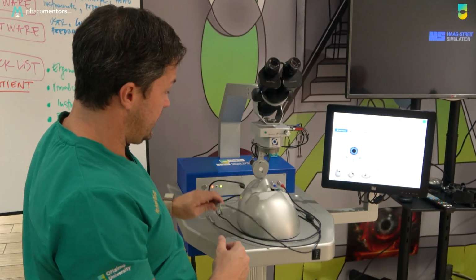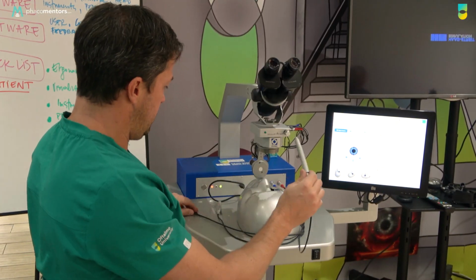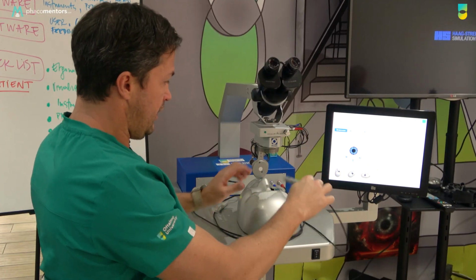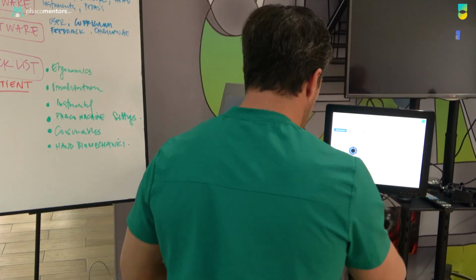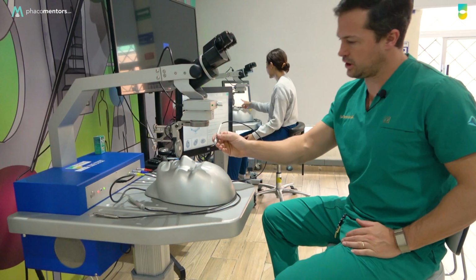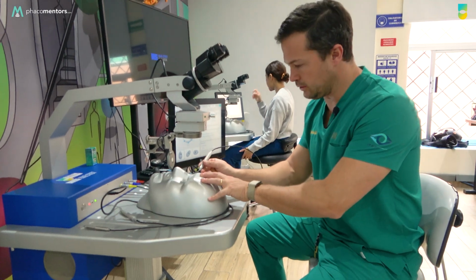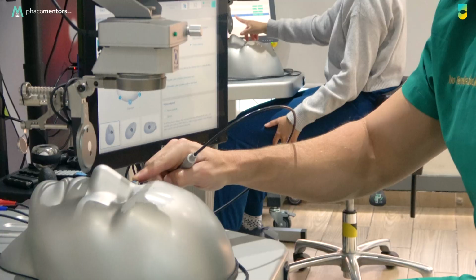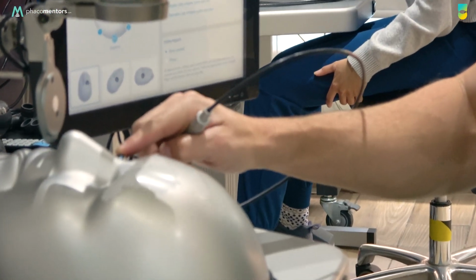The other important thing is that in order to work these sensors, as you can see, being very careful with the cables, what you're going to need to do in the machine, we're going to talk about it later, is you're going to find holes in the eye. It's going to be a right eye, it's going to be a moving eye, okay?